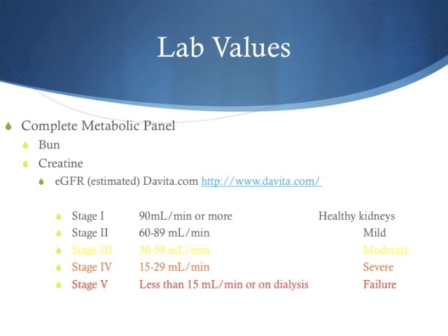The other clearance mechanism for protecting the patient from NSF is checking their lab values, getting a BUN and creatinine beforehand. MRI is now going to something called eGFRs, estimated glomerular filtration rates, versus just straight creatinine levels. So what you can do is use a tool similar to the DaVita.com calculator.